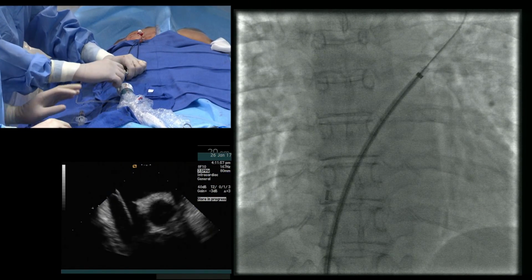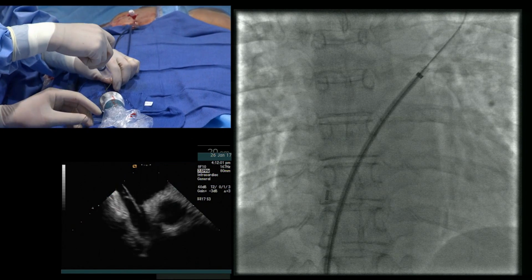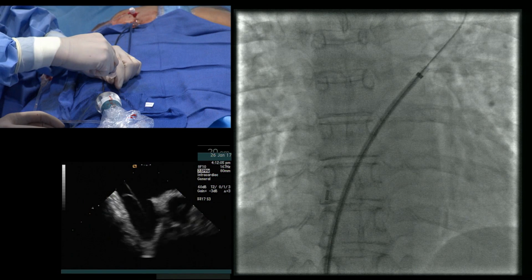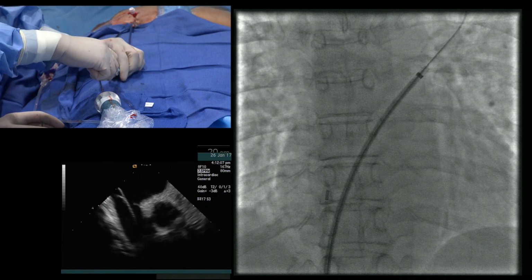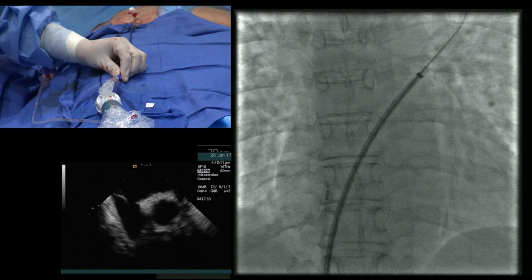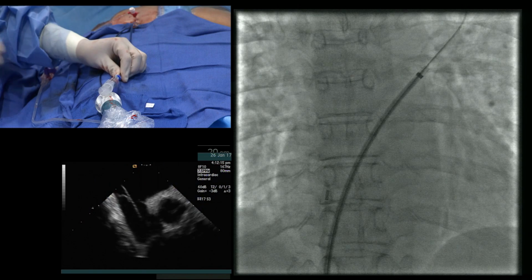Okay, great. Then we take the wire out gently, and what we're going to do is what's called reverse flushing, like we do in neurology. So that when the wire is being pulled out, we don't want any air entry into it. Okay, so we're going to need to give you another syringe. That device. Yep. So let's go.